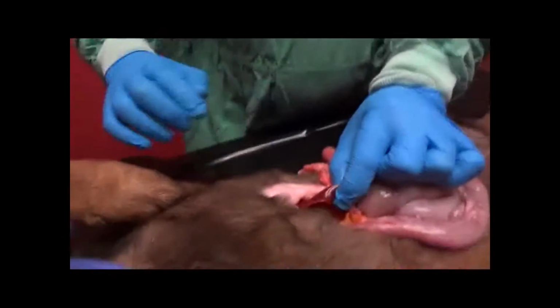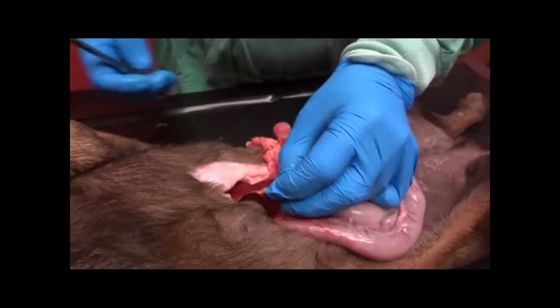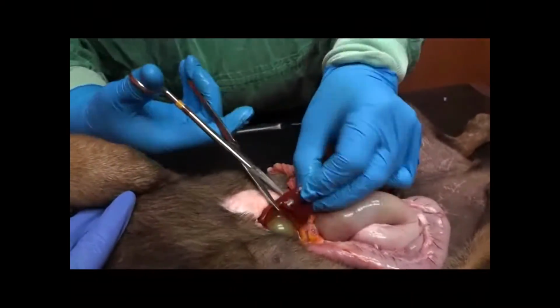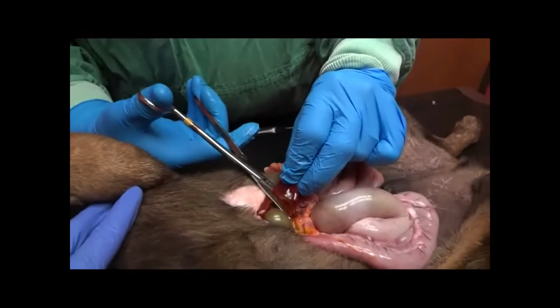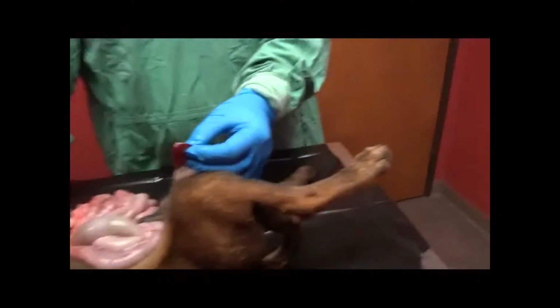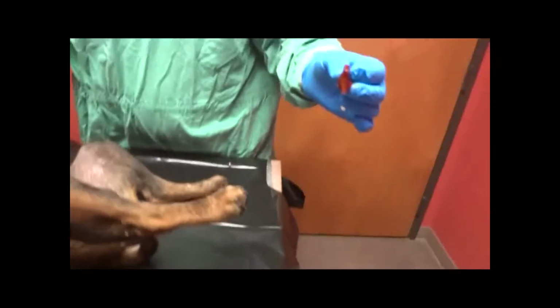So if we were sending it off for histopathology, we could just get this piece of liver here. And we can go ahead and put that in formalin and label it as such.